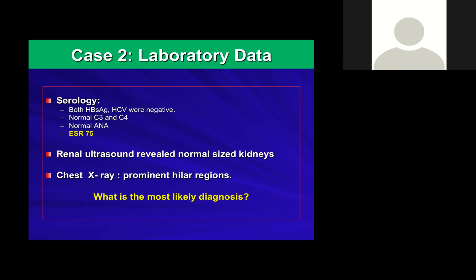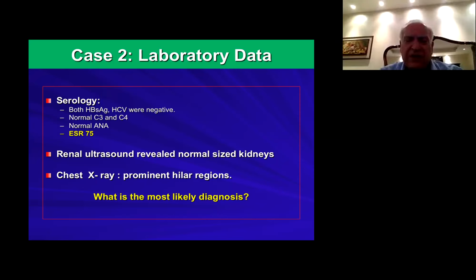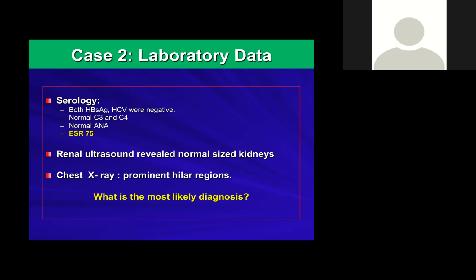The patient has hypercalcemia, impaired kidney function, shortness of breath, long-standing history of cough, and mild proteinuria. Okay, Ustad Riyad, can I comment now? Yes. Before Dr. Safa comments, most of the younger nephrologists suggested sarcoidosis as the main diagnosis.